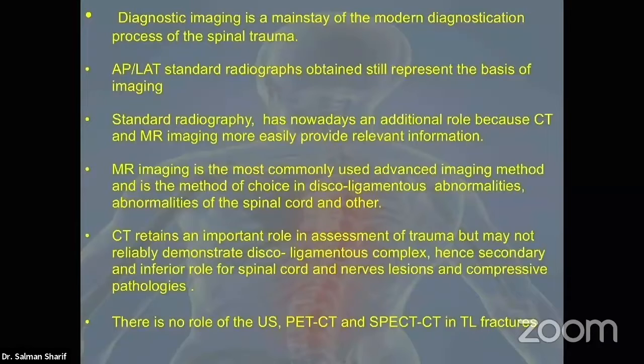Diagnostic imaging is a mainstay of the modern diagnostic process of spinal trauma. AP-lateral standard radiographs are still the basis of imaging. Standard radiography has an additional role nowadays, however, because CT and MRI imaging are more available and provide more information.